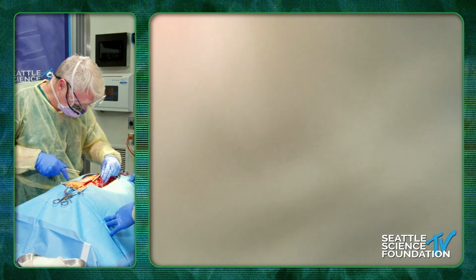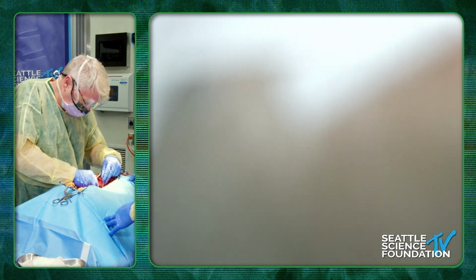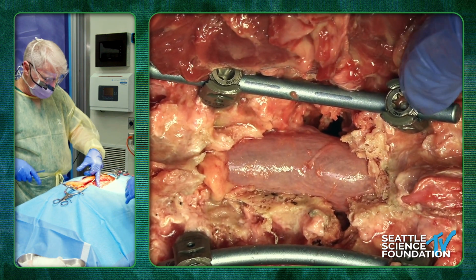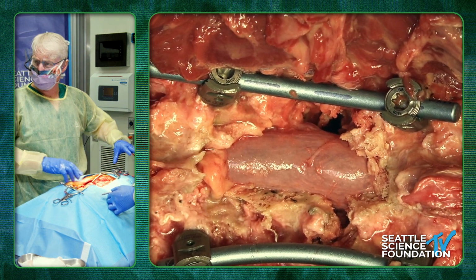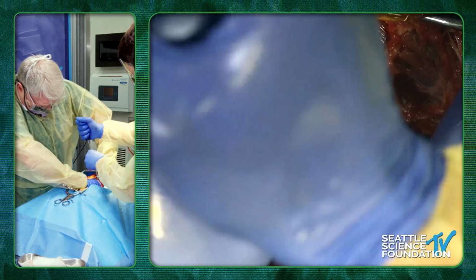So obviously we close it down a little bit more and then check that you have enough of the back wall out. And usually the way you contour your rod is very important. So if I really want it closed, I'll bend it into more lordosis at this level, and that really closes it down besides compression. There's no compressors, right? So, okay. I'll try one more time.